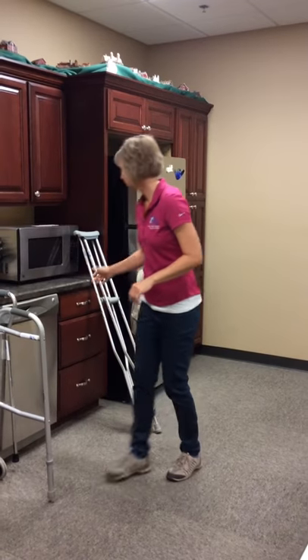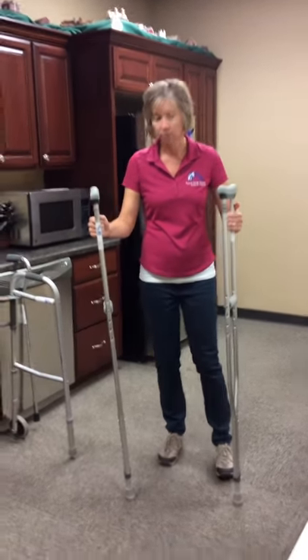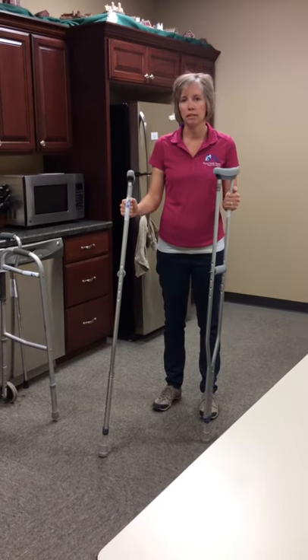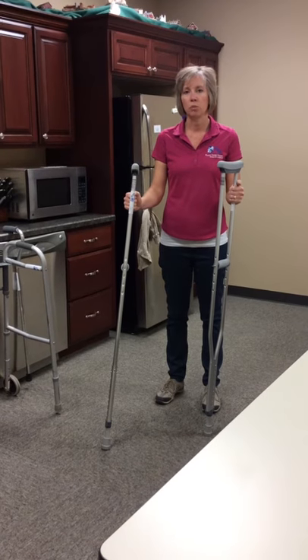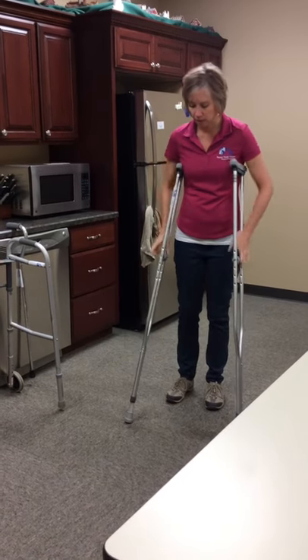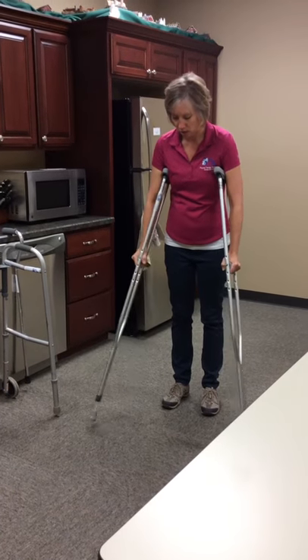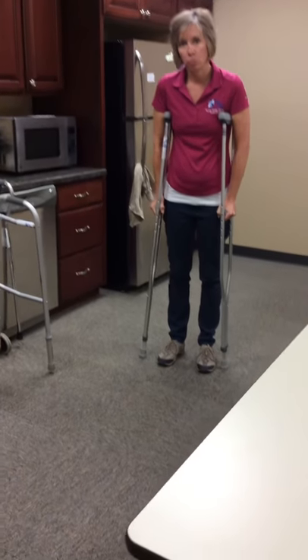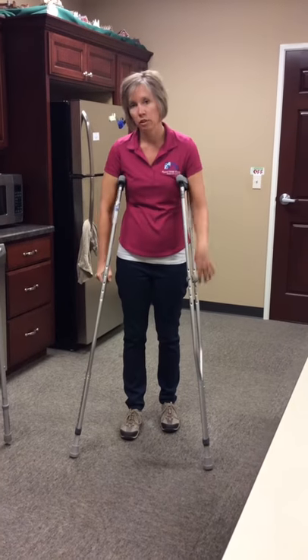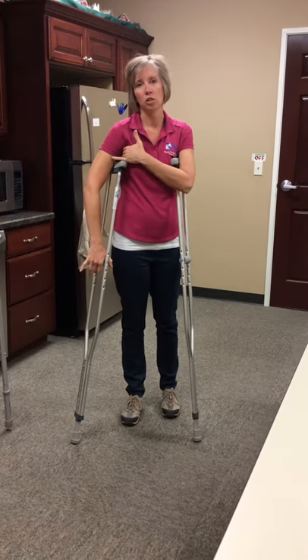Last, we have crutches. Crutches come in different sizes for youth, adult, and all different heights, so getting the right size is the most important thing. To get the right fit, you want to have your crutches positioned out a little bit in front and out to the side — you don't want them right under you. When in this position, you should have about a three-finger width between the crutch top and the armpit.